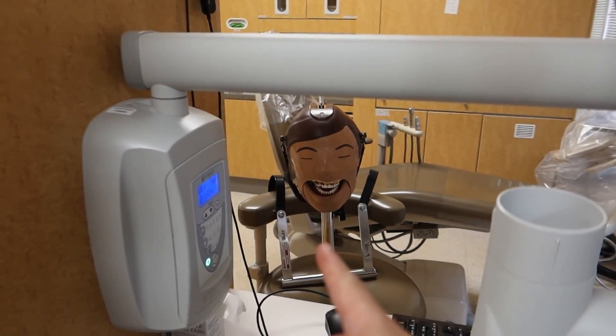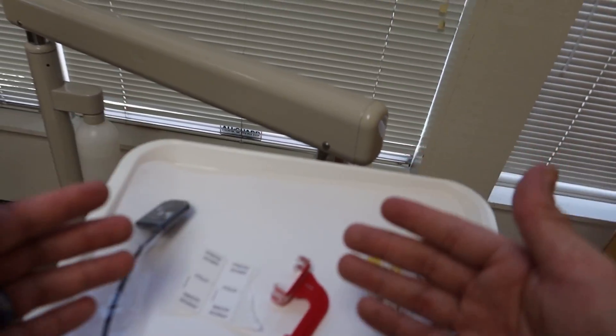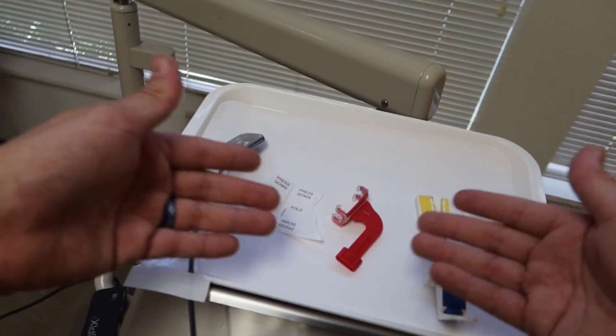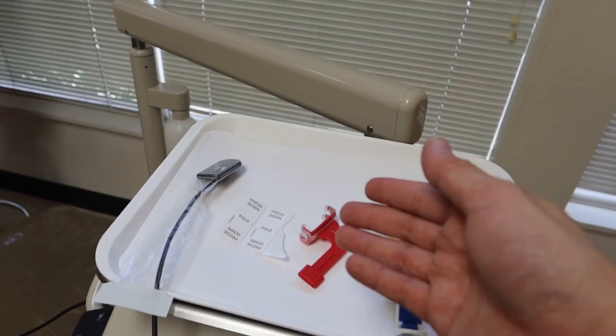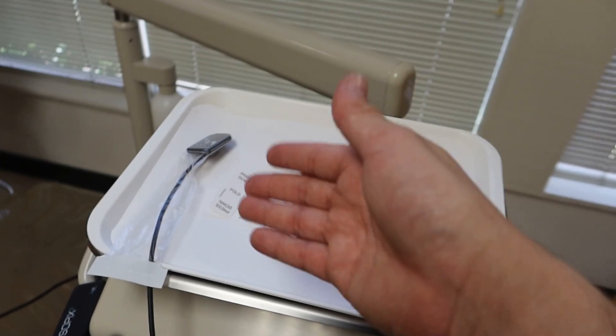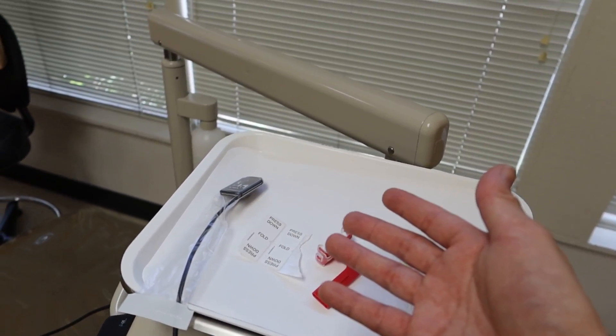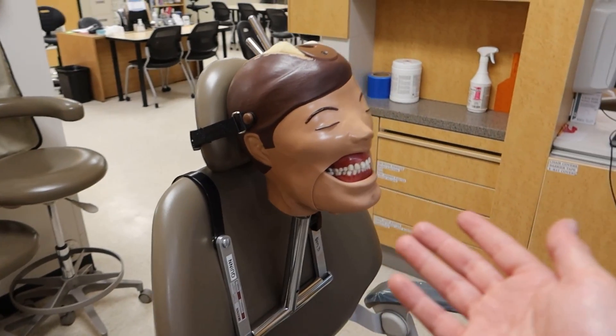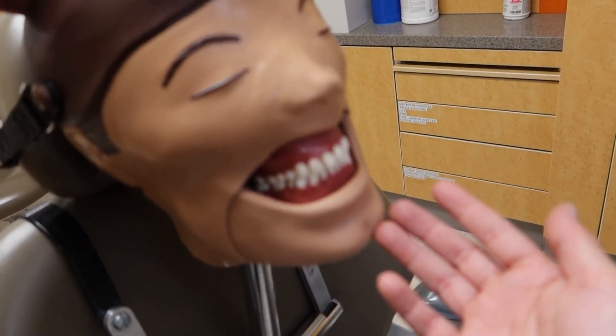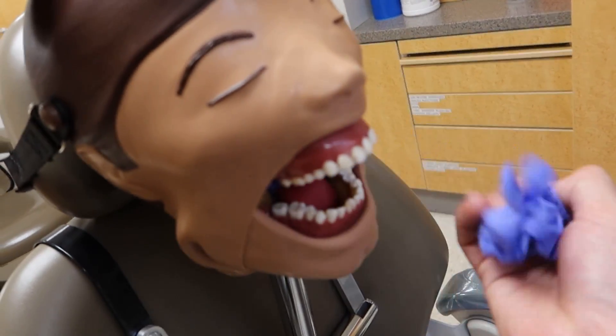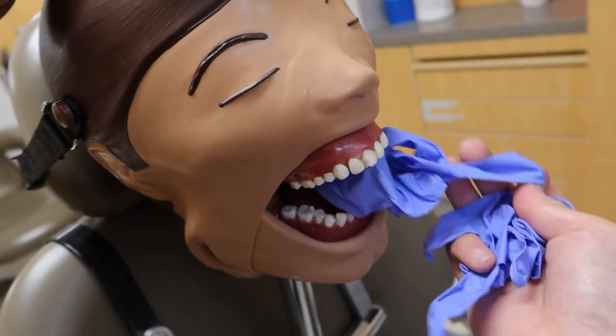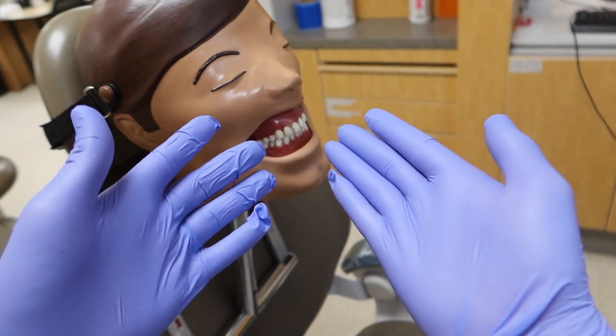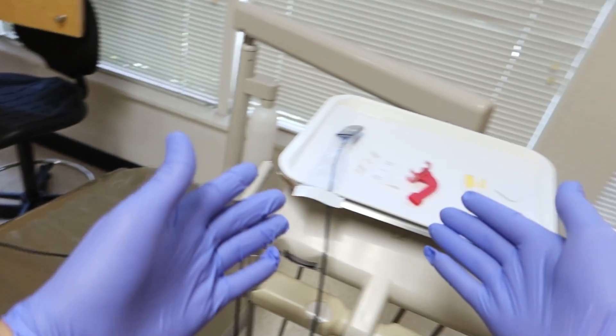I'll be with you in a moment. And so now we can go over the practice of doing a bite wing x-ray and the techniques with these different tools that we have. First, since we're gonna be going into the person's mouth with all these different tools, we need to go ahead and get gloves. So where can I find some gloves at? Well, can you help me out right here, Quinn? What do you think? Oh, thanks. Got some pairs of gloves in there. Awesome, thanks for doing that. You're always right there when I need you. So now we're all gloved up.